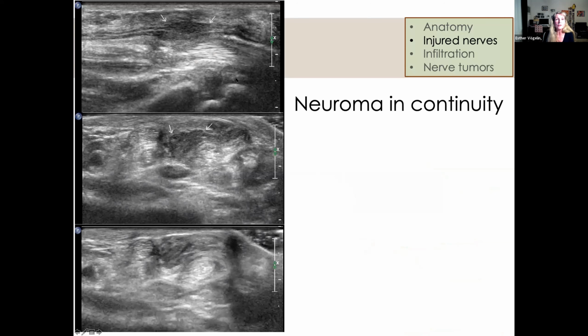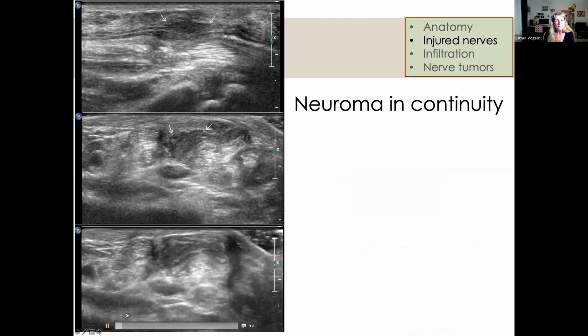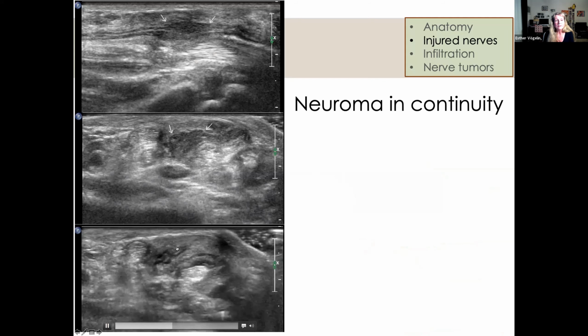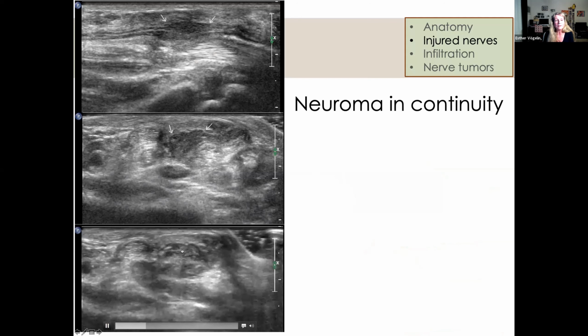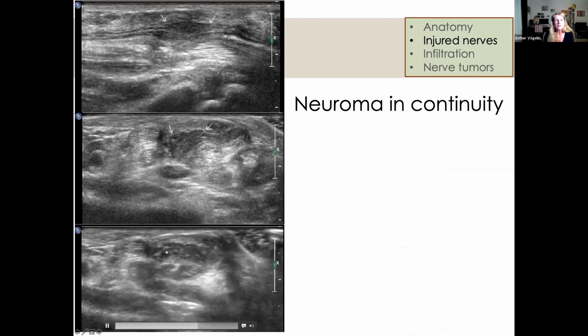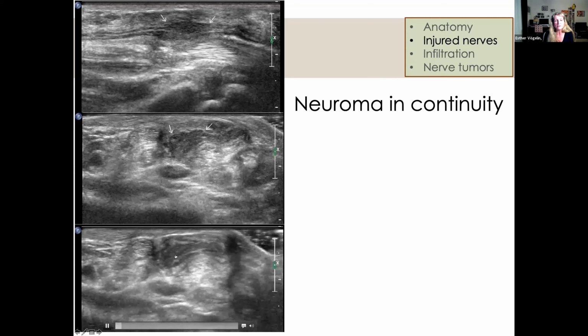You see here another example of a morphologic change. You see here the nerve fibers of a digital nerve, and you can gather that there are no fascicles in between. You see here the fascicles proximal and distal. In the cross-sectional area, you see no salami slice. And when you look at it dynamically, you see during fist, there is some tendon, lumbrical muscle, and some nerve, but the nerve is also not having a nice pattern.